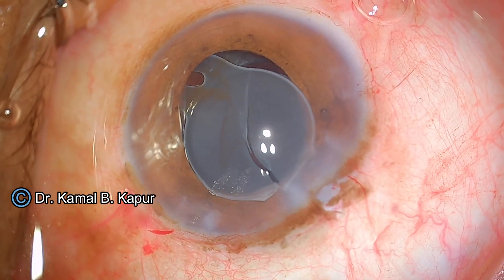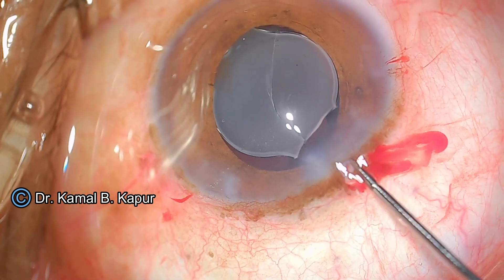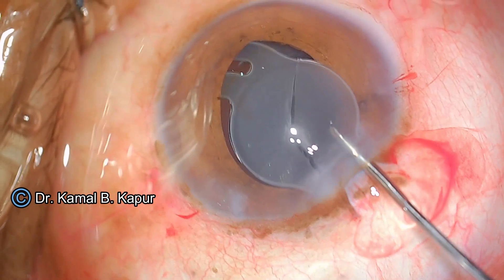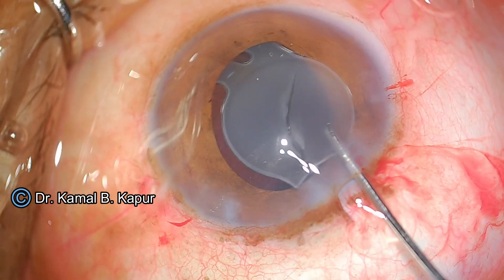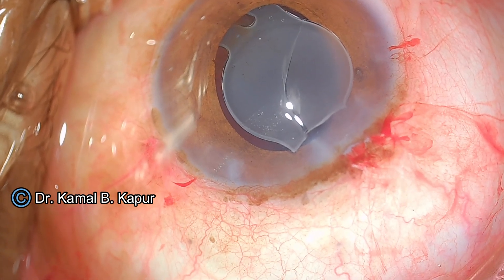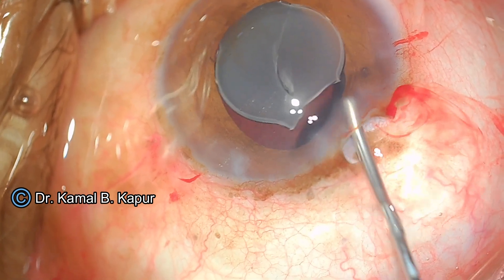I initially think I have been able to cut the lens, and I push more viscoelastic. But to my surprise, because the lens is so thick, I have only created a partial cut — especially in the terminal part of the cutter path.